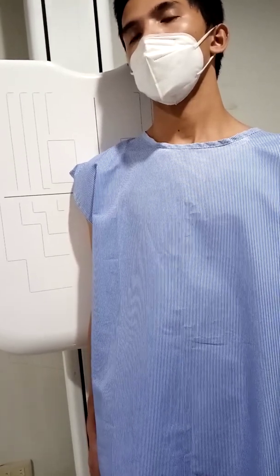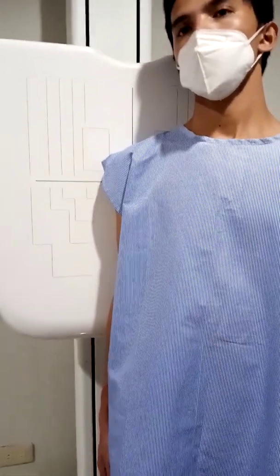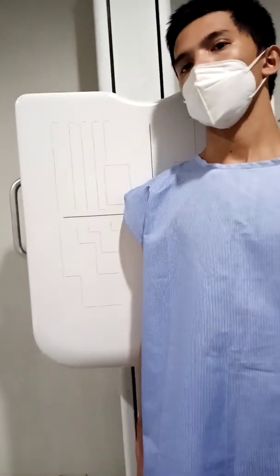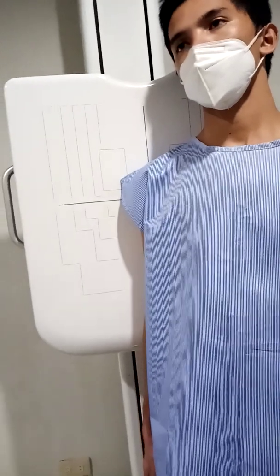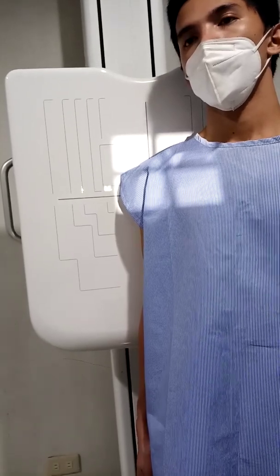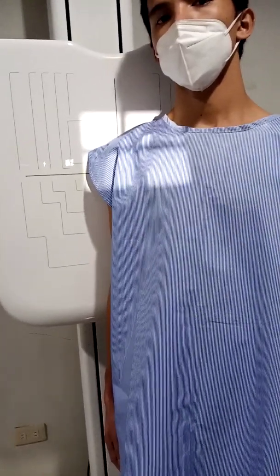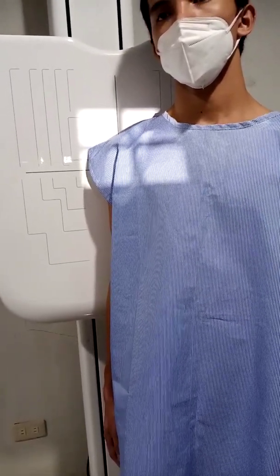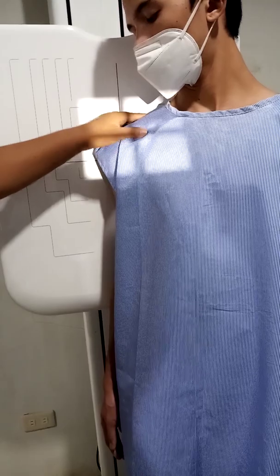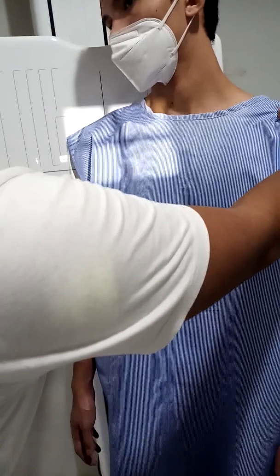Then, center the scapulohumeral joint and IR to the central ray. And make sure that you have 2 inches or 5 centimeter inferior and medial from the superolateral border of the shoulder. Then, make sure that the central ray is centered at the mid-scapulohumeral joint.